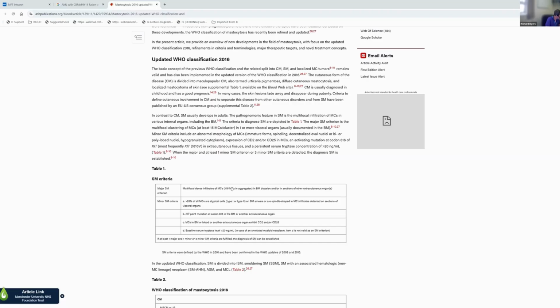Okay, what have we got else? So systemic mastocytosis is, of course, a myeloproliferative neoplasm. So we've got a couple of those to show as well. So I'll go on to the first one. This is a man born in 1962, so he's 62 at the moment. And it's query myelofibrosis. So let's just see what we've got.